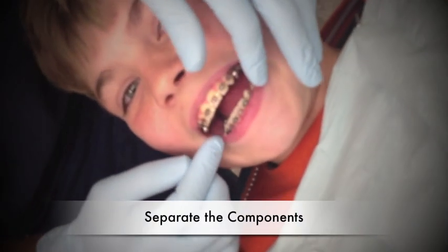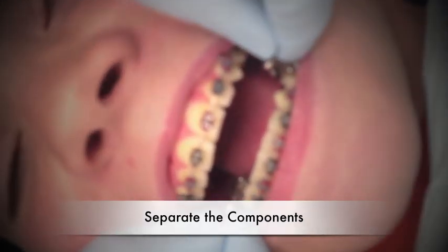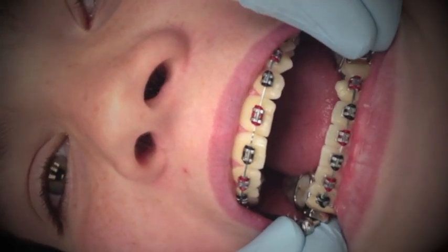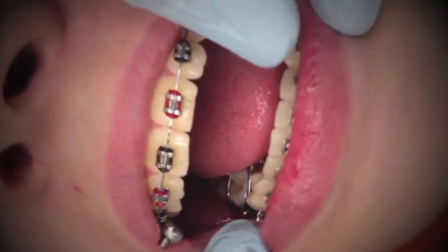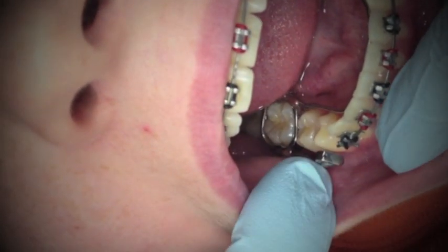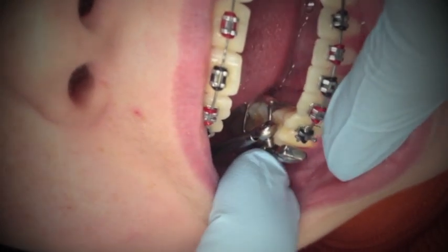We have our patient here who is going to be our demonstration. So the first thing you do — it comes in one piece — you detach these two first so you can separate the lower from the upper, then you try in the lower and then the upper. Eventually we're going to put these into this little guy here and tighten the screws. Before the appointment we took off the brackets on the four and the five because our arm would be in the way, took the impression with the bands, and sent it off.